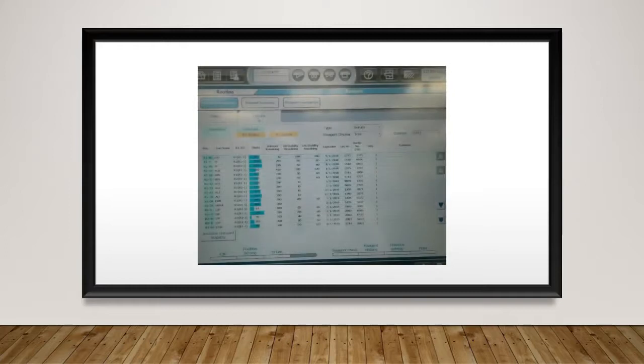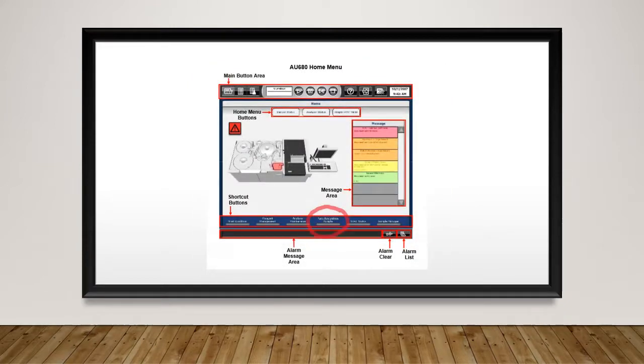Once you've finished replacing or replenishing reagents, close the covers and perform a reagent check by selecting Reagent Check at the bottom of the screen. After the reagent check, review the comments list to ensure that there's no issues with reagent placement. If everything is okay, we can proceed to Rack Requisition on the home screen to request calibrations and QCs.